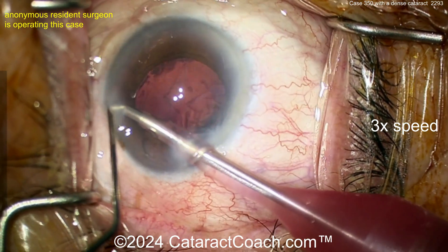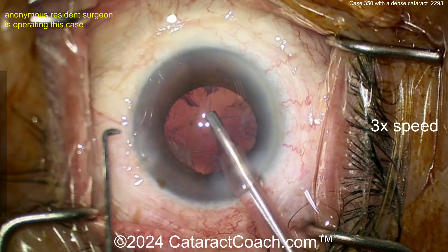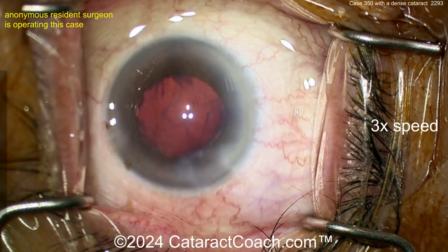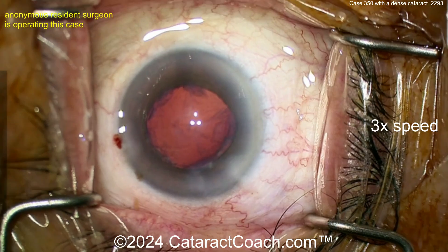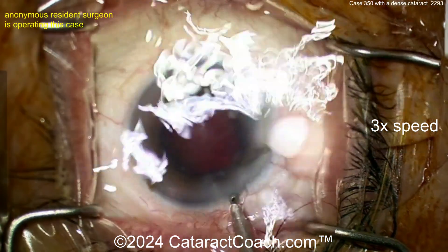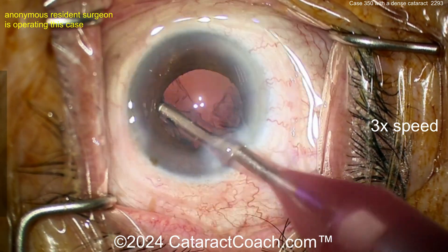Now just time for some cortex cleanup and call it a day. This is a beautiful case — I have very little to offer you, you have great skills. I appreciate the skill set here a lot. You just need to do more and more cases. Everything so far in this case is pretty good. I don't really have any criticism for you, and you know me — I like to criticize sometimes.